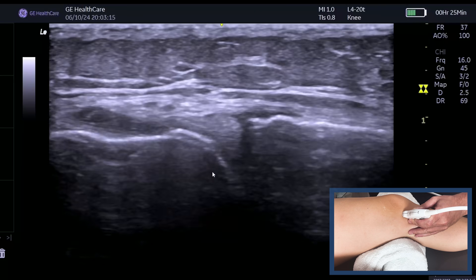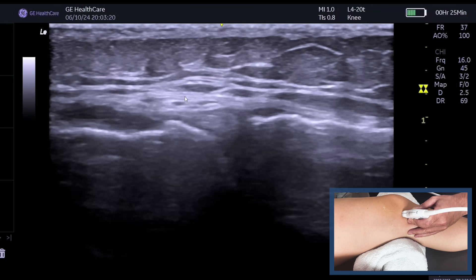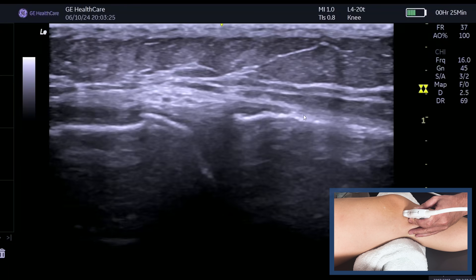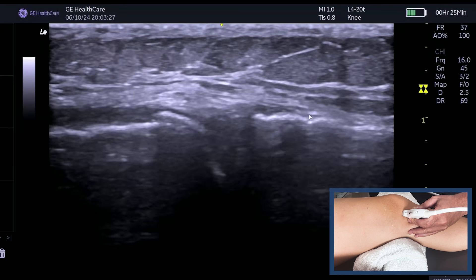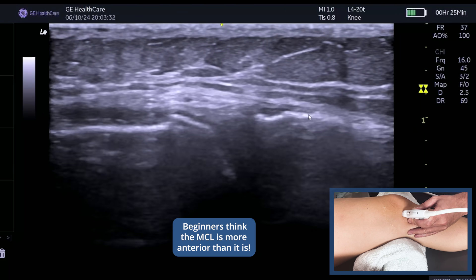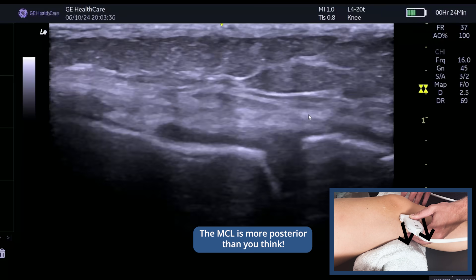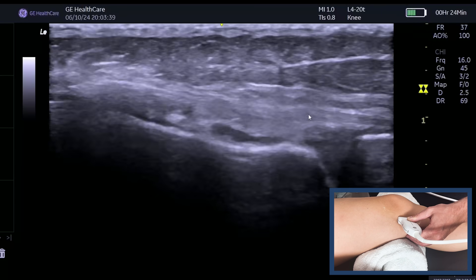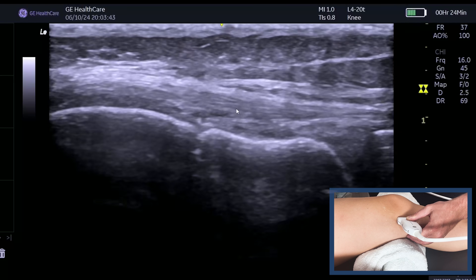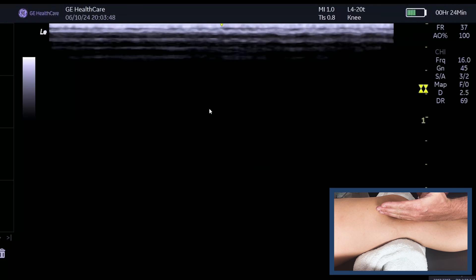A lot of people will show me images like this — do you think this is the best image we can get of the MCL going over the top? This is not a good image of the MCL at all. The reason is that this is too anterior. You've got to remember, particularly when the knee is towards extension, the MCL is more around the back of the knee. So we can start to see this lovely fibrillar pattern of the MCL.